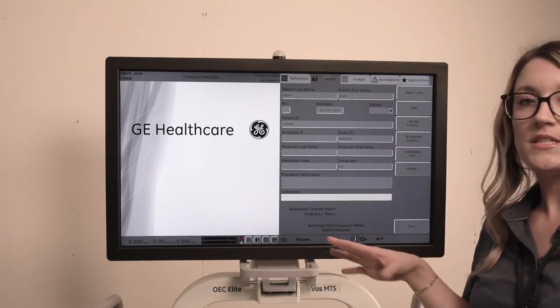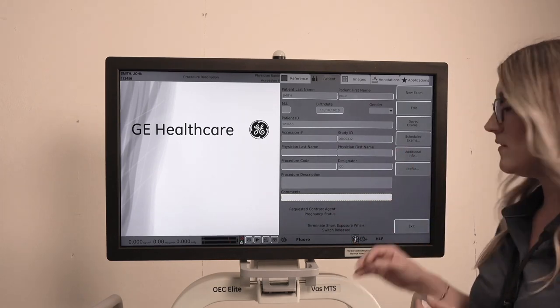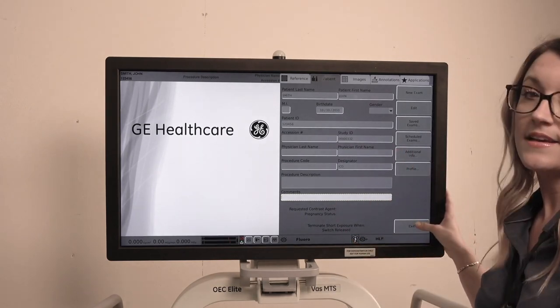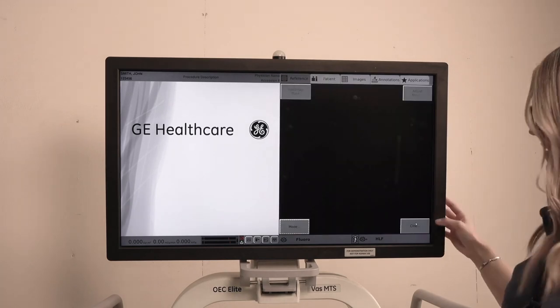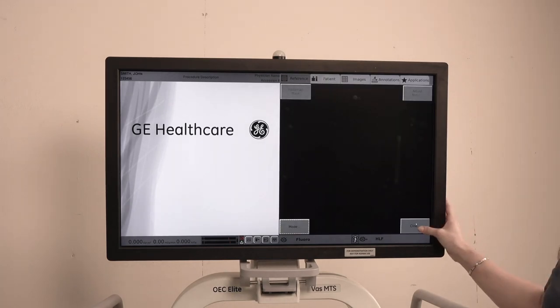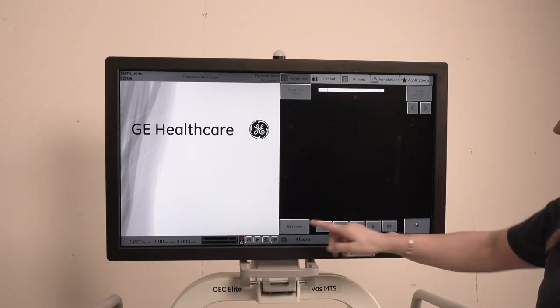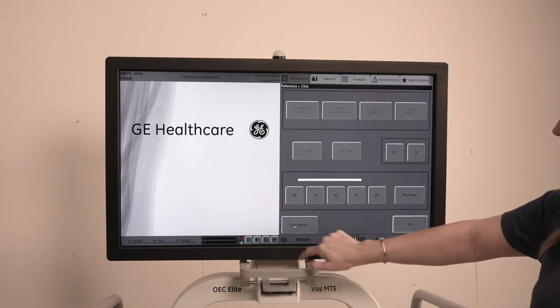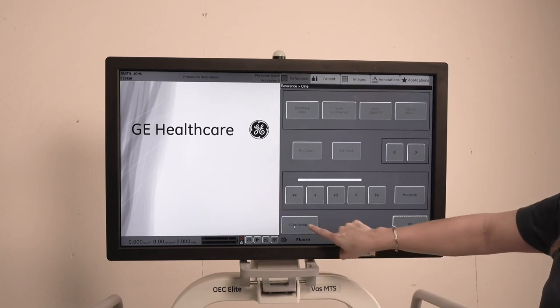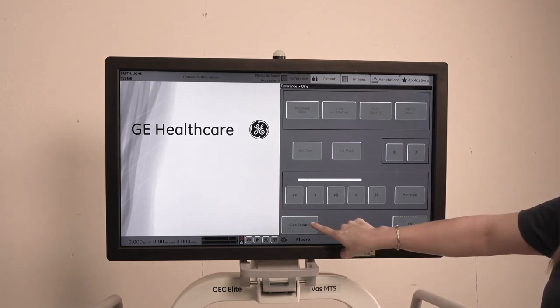So once you have the patient's information in, you can just hit exit and then hit CINE here in the bottom right corner. Maximize and then you'll go to CINE setup.